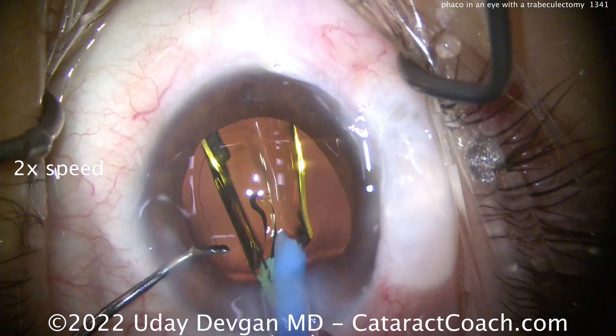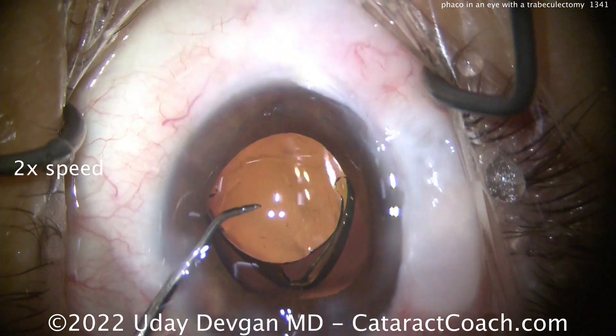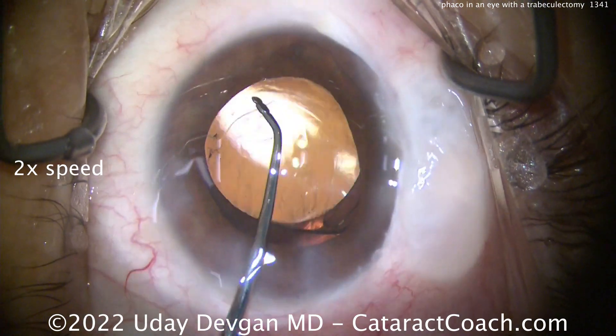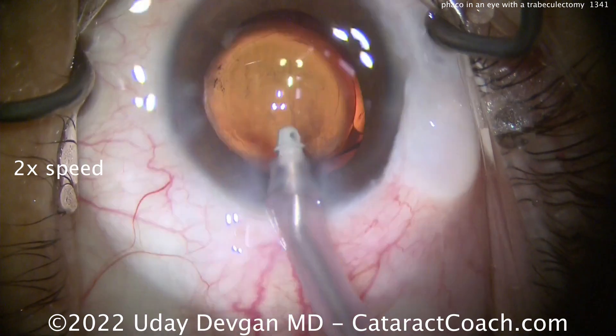I really like to have a monofocal lens in patients with more advanced glaucoma disease, and it's also the request of the glaucoma doctor. This patient is getting a monofocal lens with a goal of plano OU. He started off with a little bit of hyperopia, so he should be very pleased.